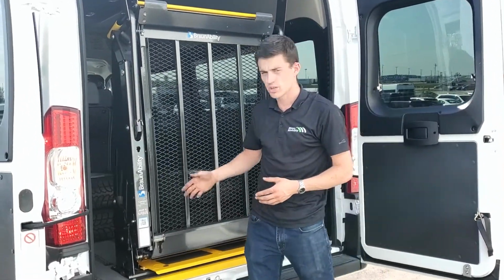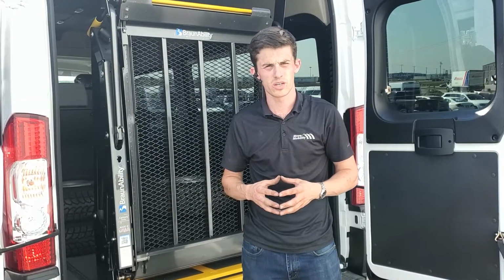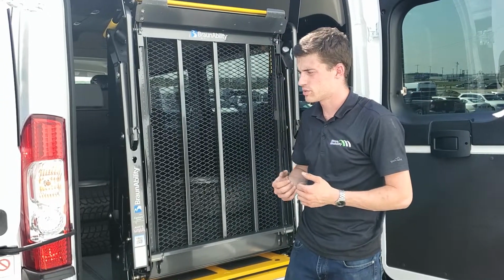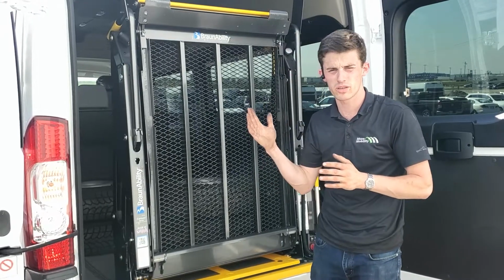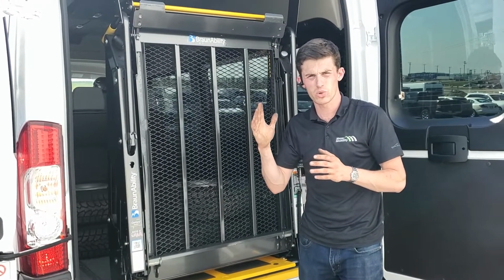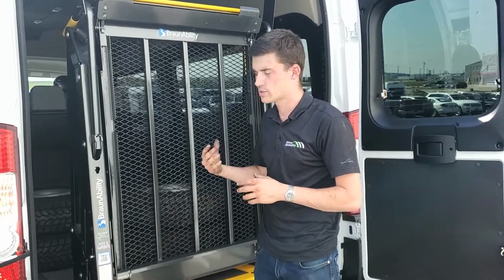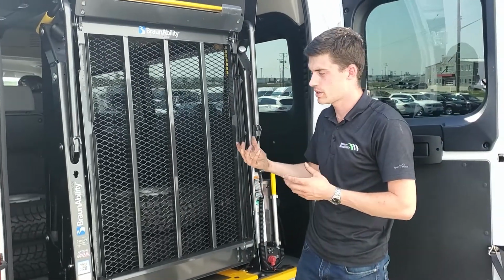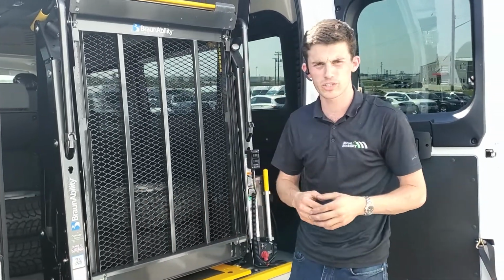Now, these safety hooks are not to be used during transportation. Some clients get frustrated when the lift doesn't come out, and we find that they're actually bringing the lift all the way into the vehicle and then releasing the lift slowly to let it catch on the hooks so they can transport their patients, their clients and whatnot with the lift caught on these hooks. I'll just briefly show you what that looks like.